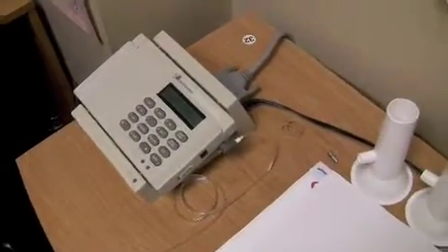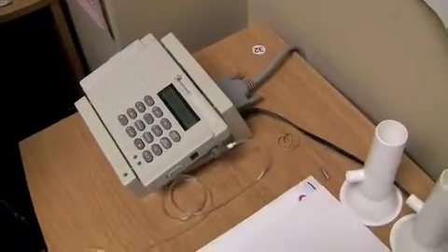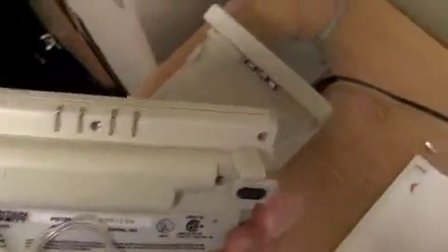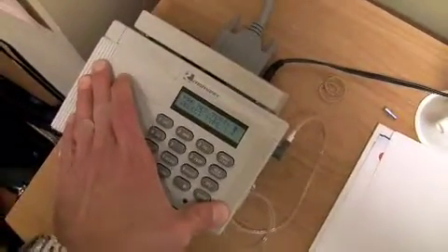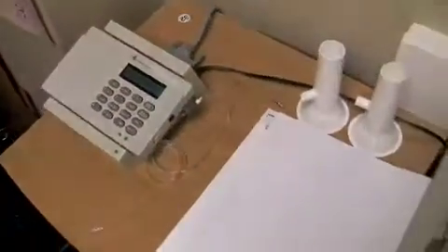Okay. And at this point, it's imperative that you make sure that the computer is firmly seated with the contacts on the back against the contacts on the base unit. So you make sure it's seated well and push in so that it snaps into place.